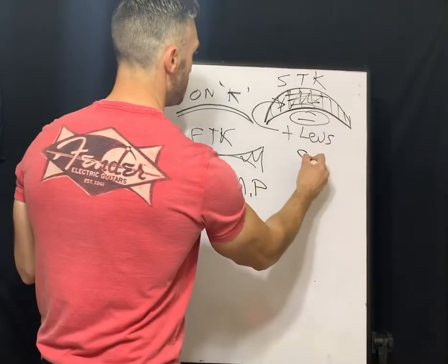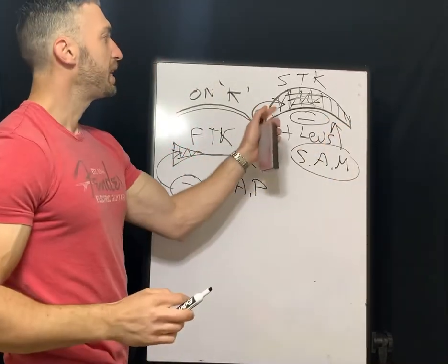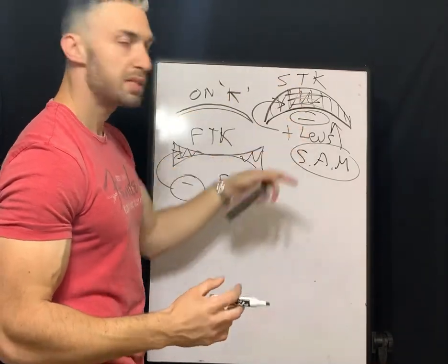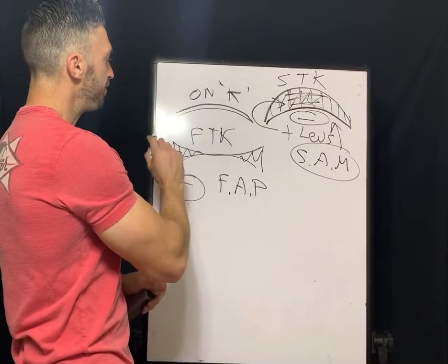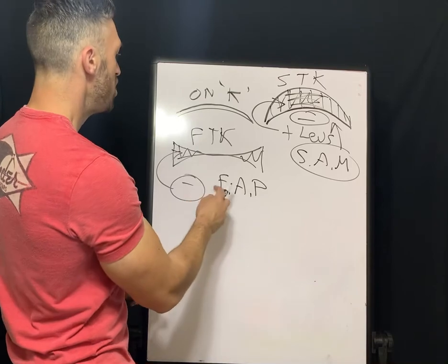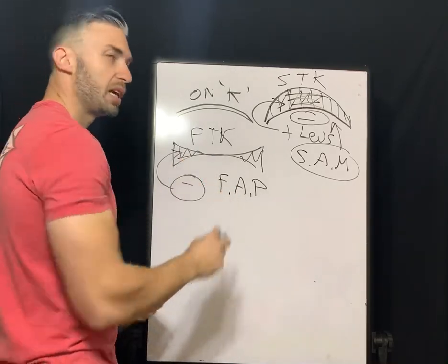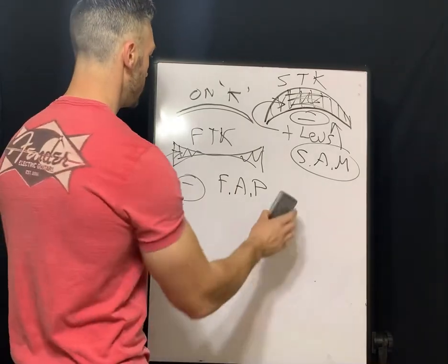And that would be steeper, add minus, right? Because if you're fitting it steeper than K, it creates a plus power lens. You're going to add a minus power to your prescription, and it's going to neutralize it. Much like if it's a flatter than K curve of the contact lens, you're going to add plus to the prescription, and it's going to neutralize that minus lens that you created. So I hope that helps to illustrate why we're doing this.